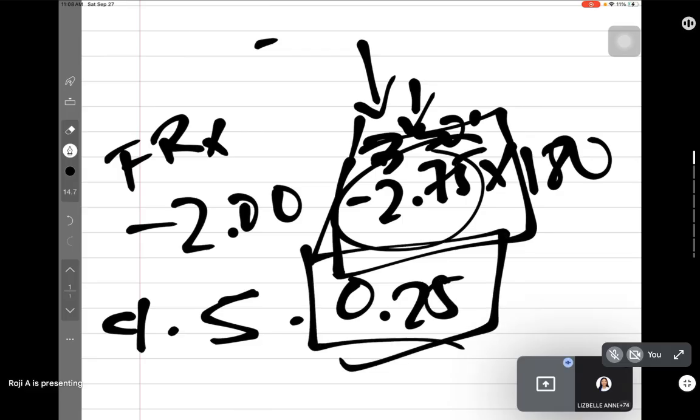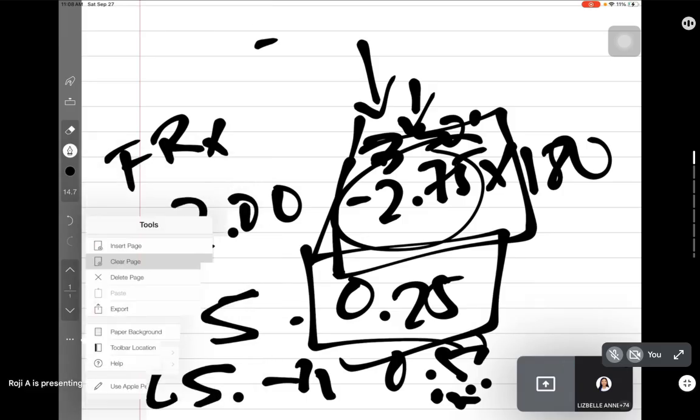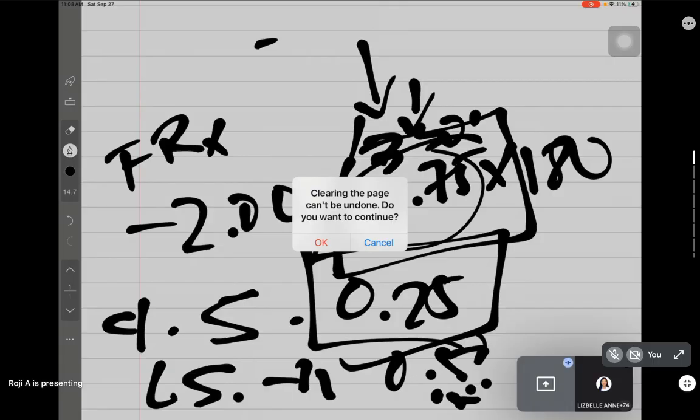So I can give you an estimation as it goes higher. 6.50 to 7 should give you about 50. And it goes higher and higher, 75, 1. The higher the power, the higher the difference. Is that clear enough for you, Doc?